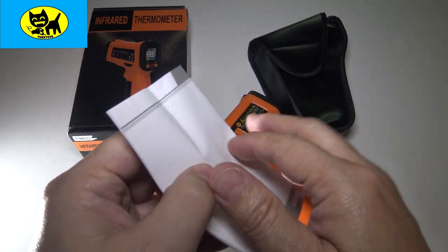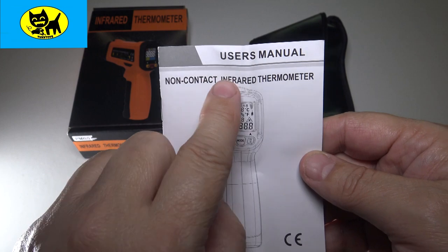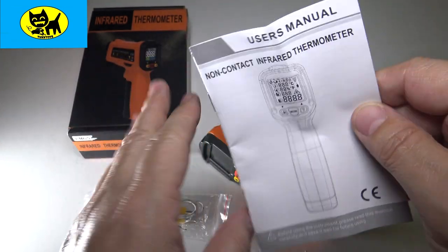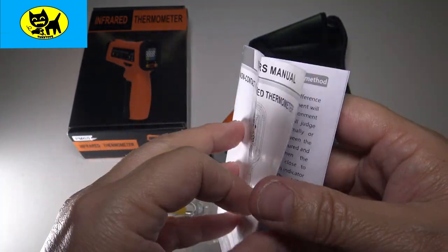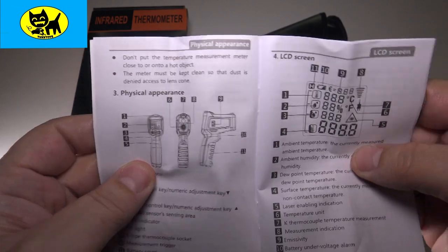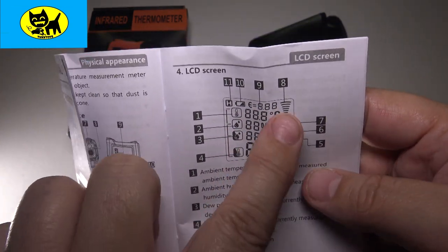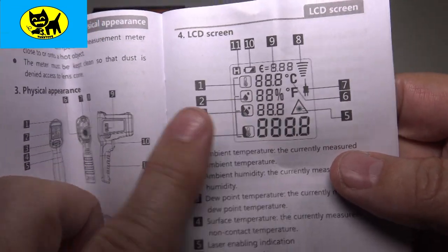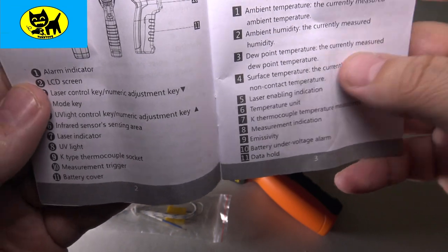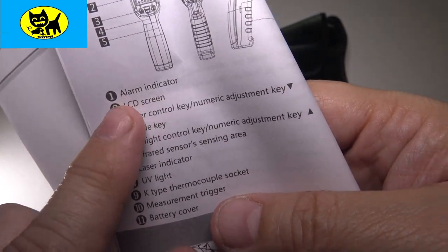Let me take a look at the manual. Right here it shows the no-contact infrared thermometer — get that temperature without any touchy-touchy. It talks about the different features and everything on the gauge: Fahrenheit, Celsius, percentage, all sorts of things. It also has alarm indicators so you can set an alarm for people with a fever over 104 — not a bad idea.